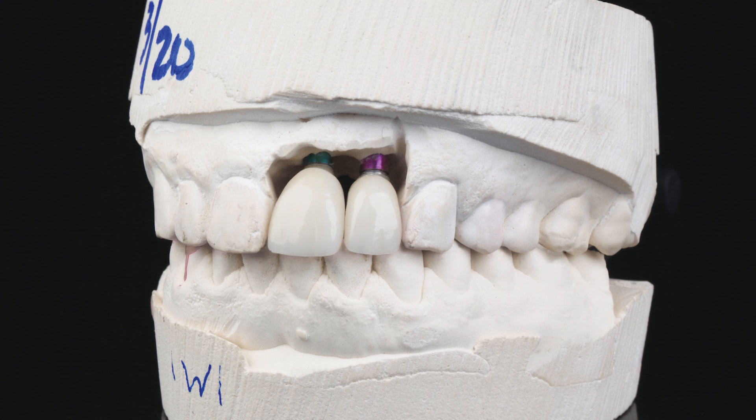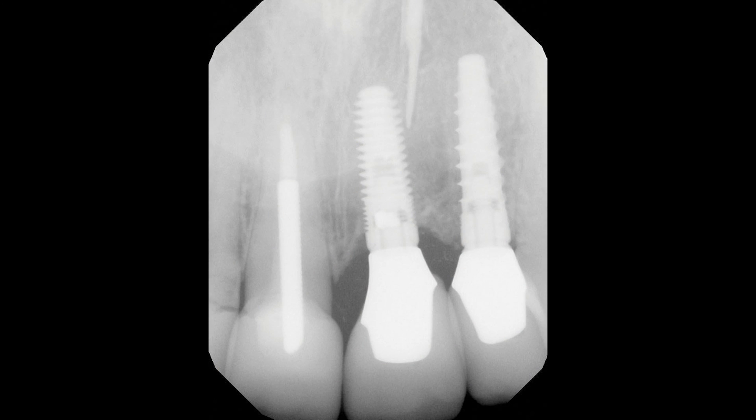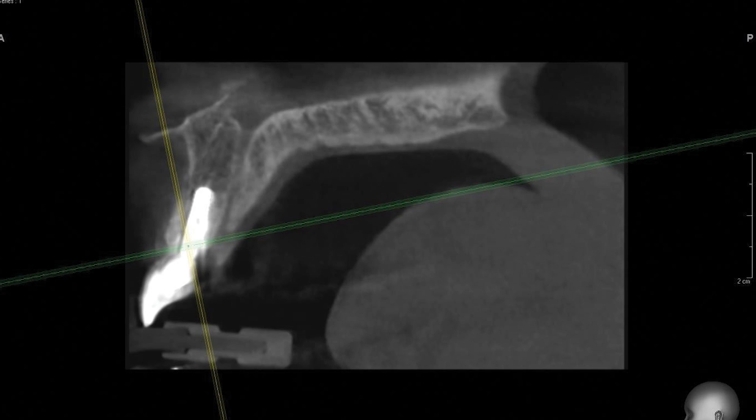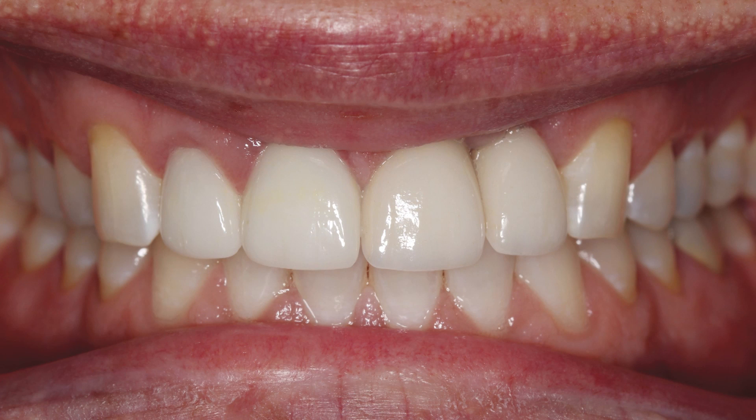The crown, which was digitally designed and milled using CAD-CAM technology, exhibited a precise fit. Final digital radiography illustrated superb bone preservation at the implant site, and CBCT scans show the sagittal view of the facial bone and the optimal position of the dental implant. The final restorations exhibited translucency, color, and emergence profile similar to natural dentition. The patient, who possesses a high smile line, was very pleased with the final outcome.